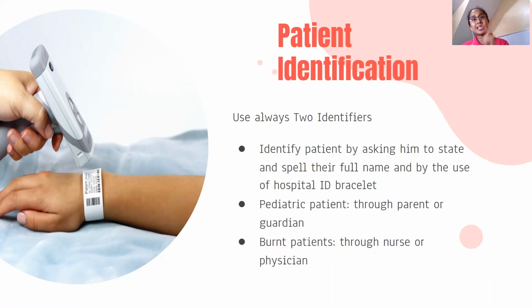So, how do we identify the patient? By first asking their name. Ma'am, what's your complete name? Please do not simply ask the last name. Do not simply ask the first name. What's your complete name, ma'am? You never ask, are you Ma'am Angeli? Are you Sir Patrick? We don't do that.